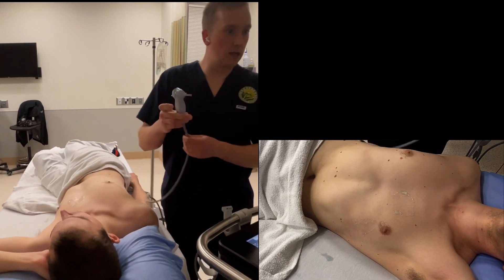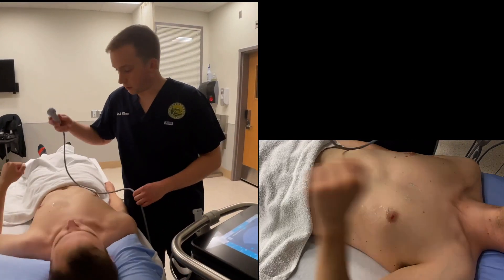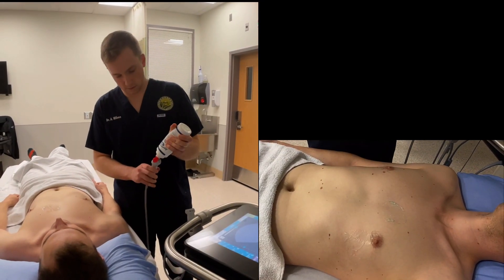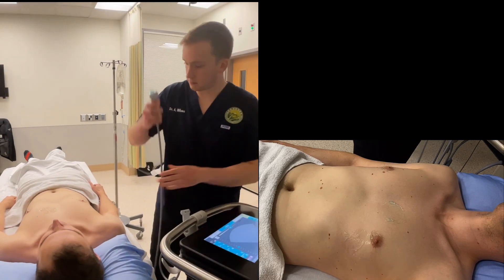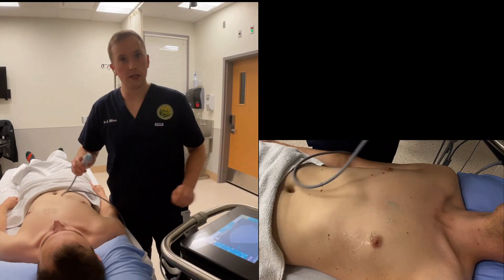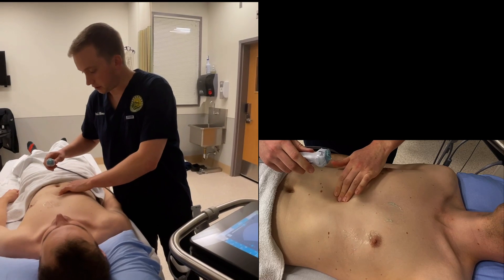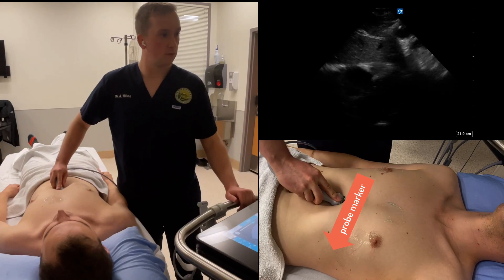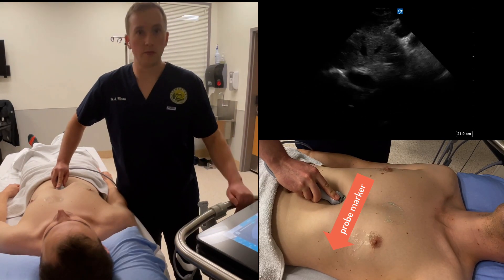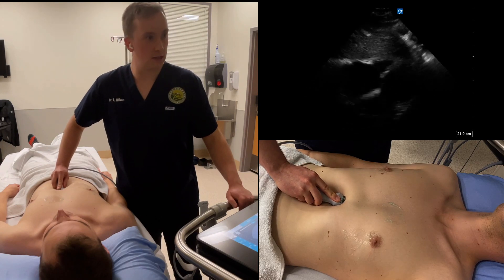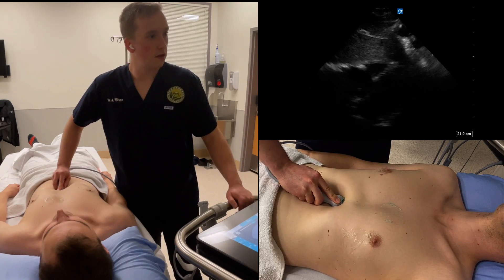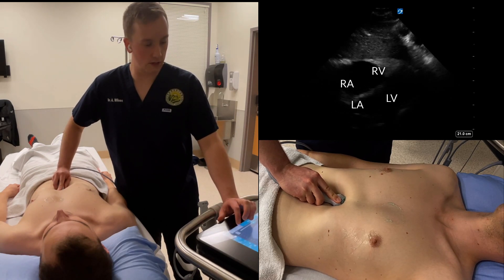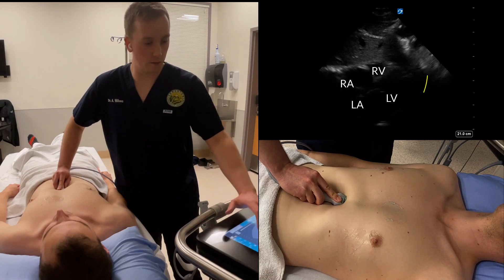The next image we'll obtain is the subcostal four-chamber. For this, you want the patient to lie supine. Take the probe and place it immediately inferior to the xiphoid process with the probe marker facing the patient's left. It's important to depress the probe and fan slightly anteriorly to look at the heart underneath the sternum. You should see all four chambers of the heart, the tricuspid and mitral valve, as well as the inferior portion of the pericardium.